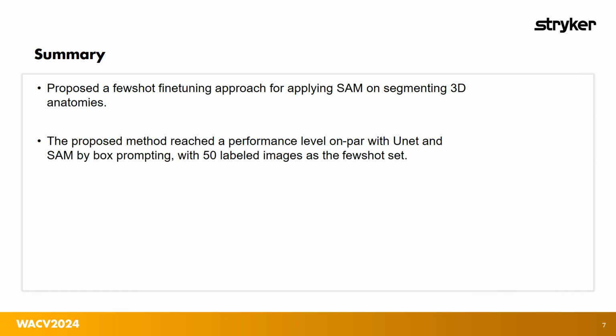To summarize, we propose a few-shot fine-tuning approach for applying SAM to segmenting 3D anatomies. The proposed method reaches a performance level on par with UNet and SAM with box prompting, with only 50 labeled images as a few-shot set.